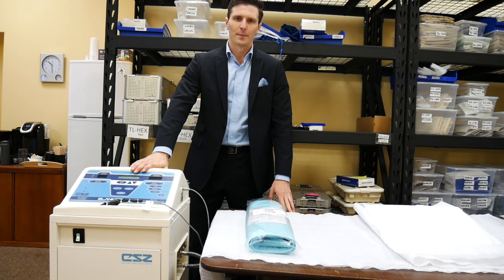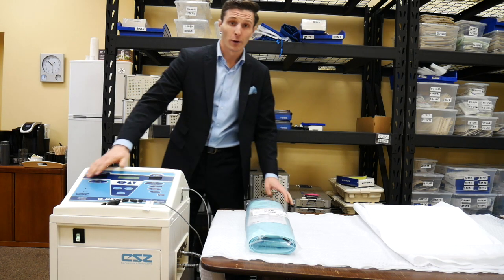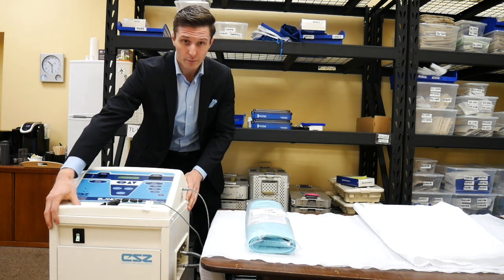Hello, my name is Grant Goossens. I am the sales director for MedQuest Medical, the exclusive distributor of Gentherm CSZ products in Canada. I'm going to do a quick rundown on the Blanketrol 3 right now.